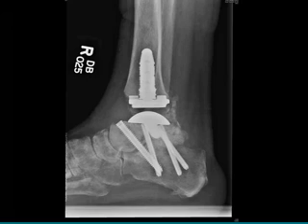But I knew that, but I thought we could get by. So I did the INBONE ankle on her some years ago. I did a minimal exposure to her subtalar joint, and then we put fusion bars underneath the prosthesis, understanding that it might collapse. So there's several things wrong with this. One, I don't think these kinds of patients should be done with total ankles. I think they have a high incidence of failure.